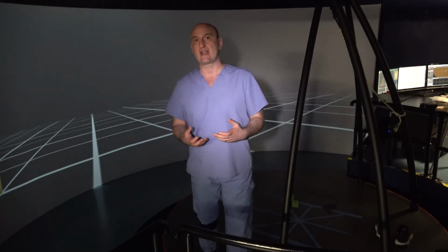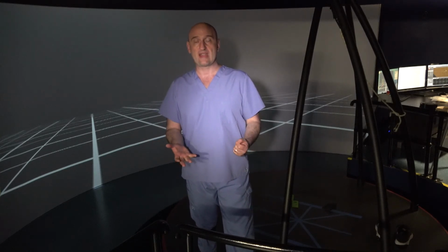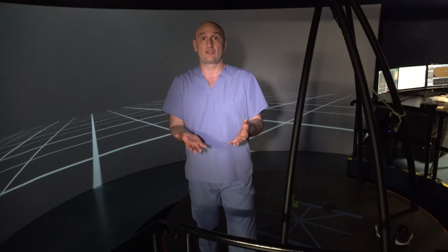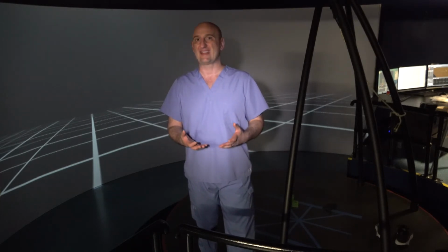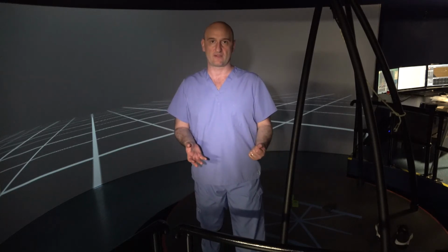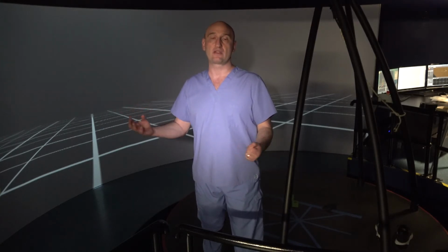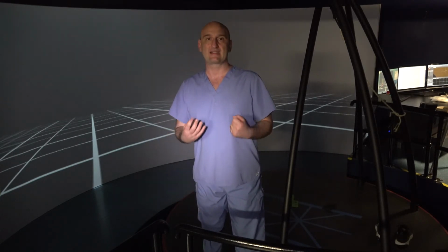Neuroscience has had fantastic development in the last 10 years, and we know that training a task the way we usually do in physical therapy, where we tell the patient to do something and to focus on that movement, doesn't really change much. Yet there are some results, but it takes forever and forever to rehabilitate this way. How is this better and how is this different? Because of the direct feedback and multiple different sensory components that we can create and give the patient as feedback, whether reactive or built into the scene, that enhances neuroplasticity.